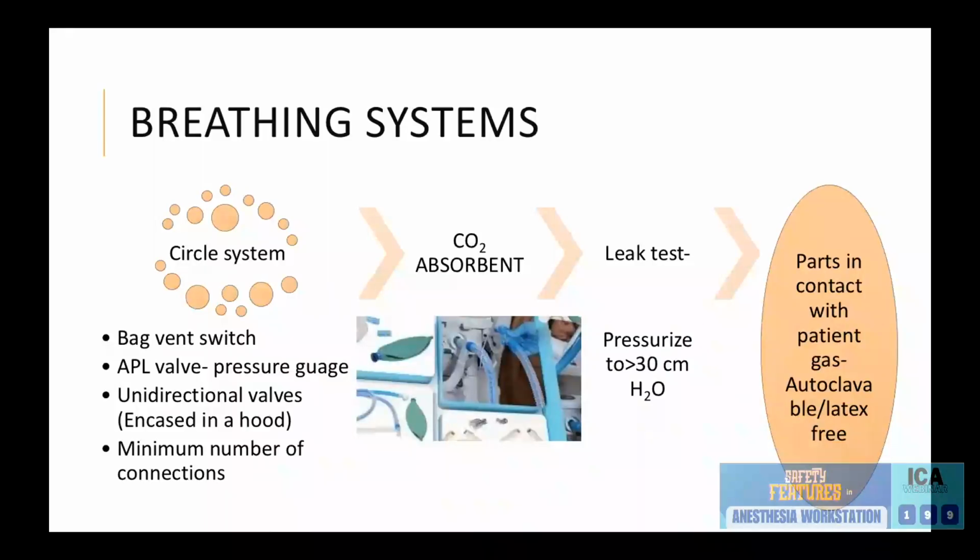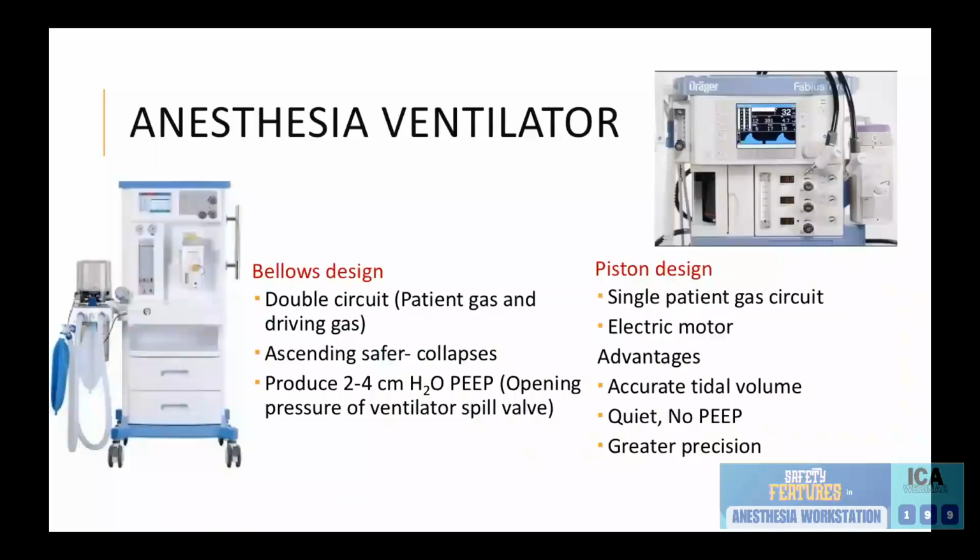There is a carbon dioxide absorbent, which is color-coded. There are tests, and some parts of the breathing systems are autoclavable. The soda lime canister is autoclavable. These parts are latex-free. So all of these are, in a way, safety mechanisms, right?